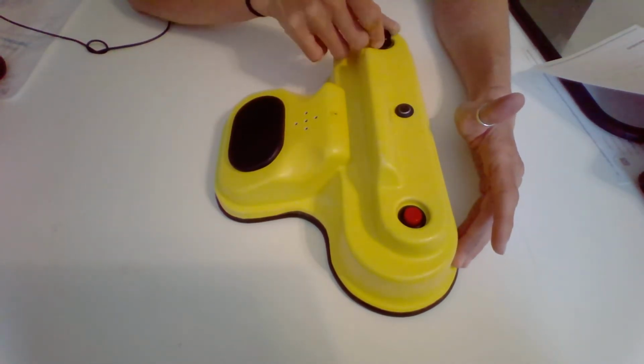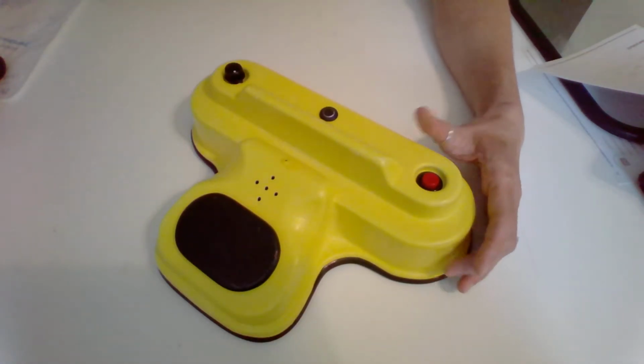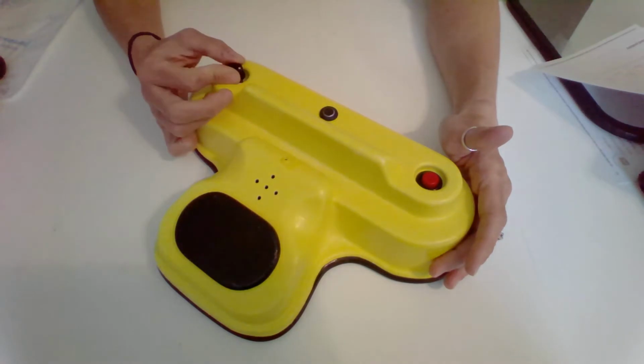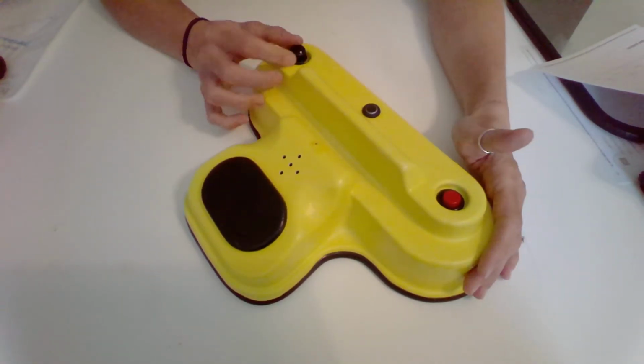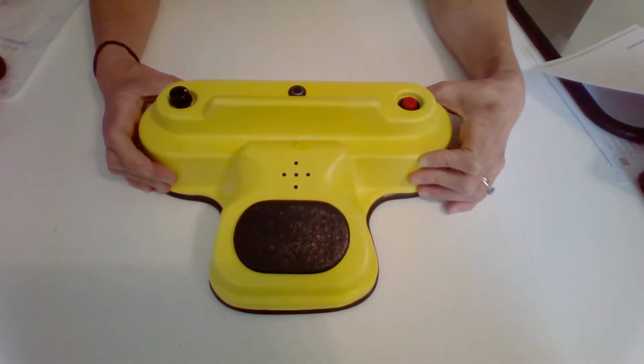And you can't lock this volume down. That's one thing that is a bummer for kids because a child is going to figure out how to manipulate the volume. But if you need it lower, you could try setting it lower and see if they could not touch it. But you know, good luck. So anyway, that's pretty much this little device.